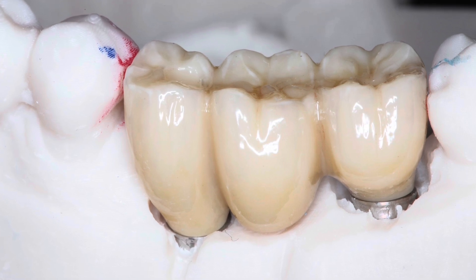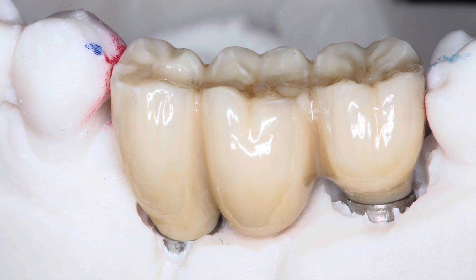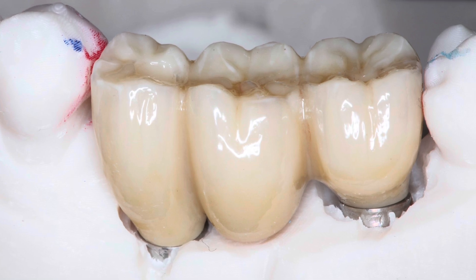I don't think it makes sense to have a small abutment cemented in. Here, the multi-unit is in place and the bridge sits directly on top of it, held together by a screw.